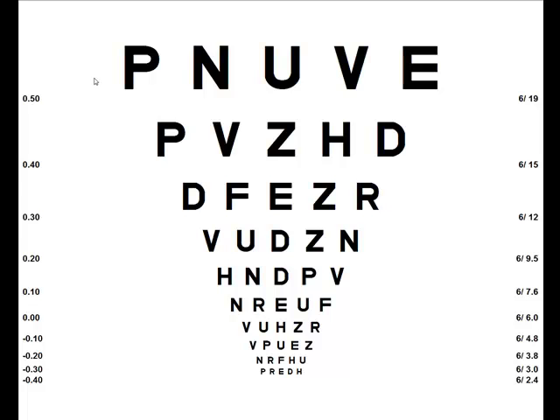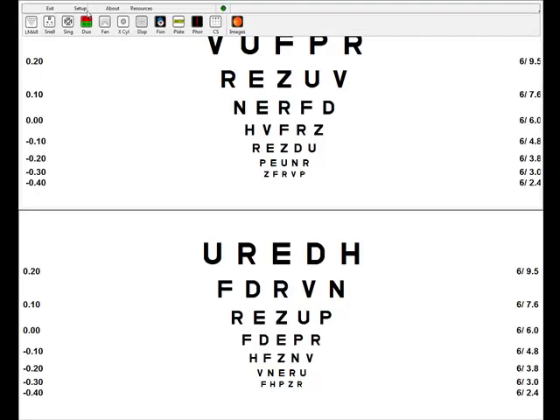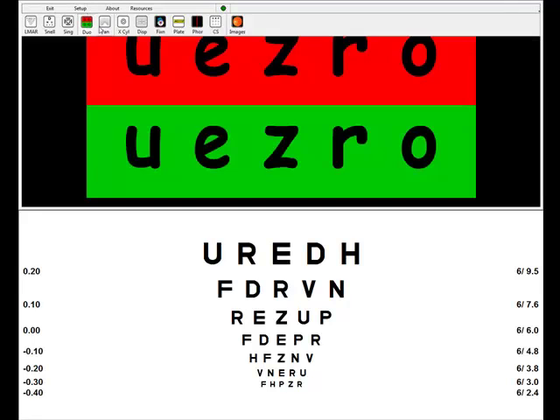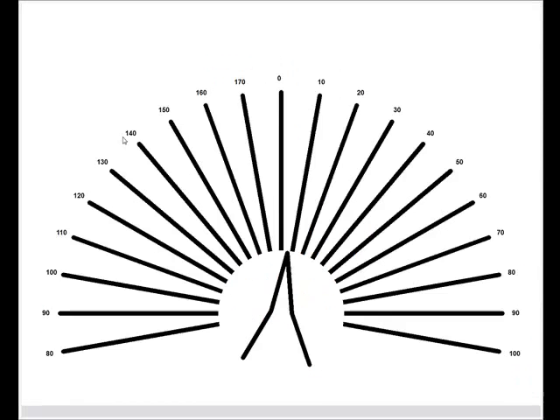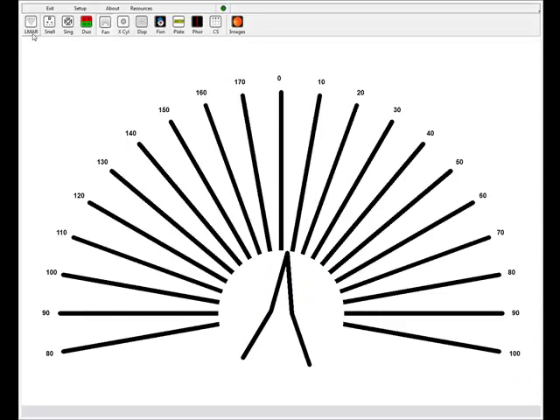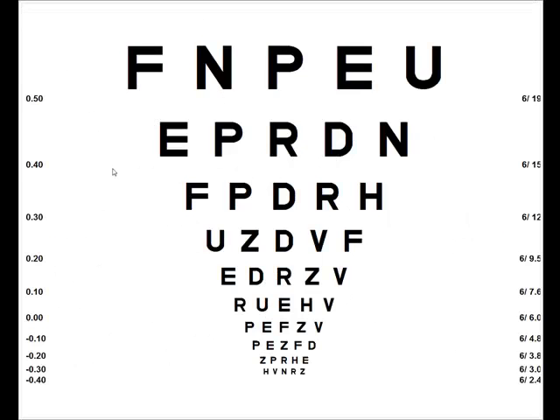You can display more than one chart simultaneously. If you press S on the keyboard or on the remote control, it will split the screen. Then you can display different charts above and below the line. To get rid of the split, you just press S again. I hope that demonstration has been helpful. Thank you very much for listening.